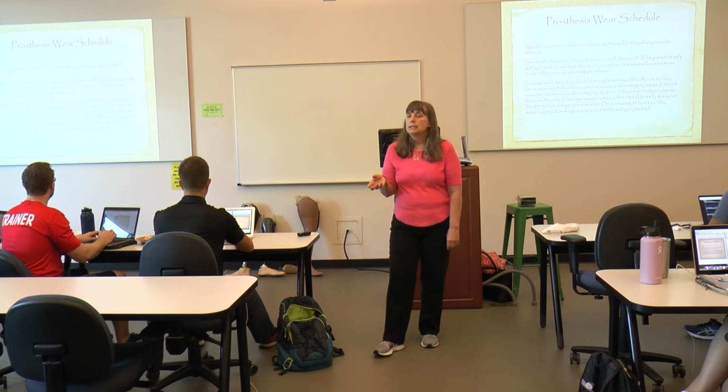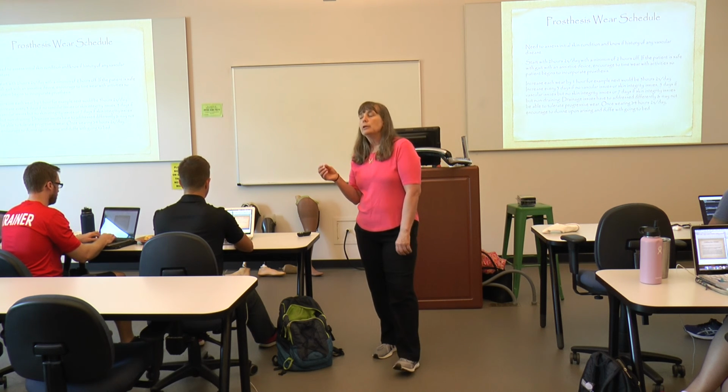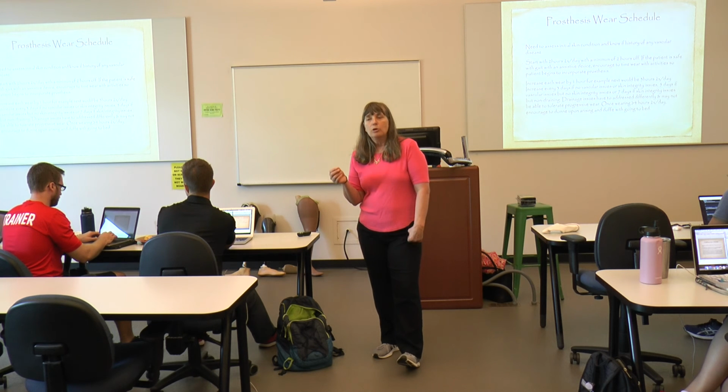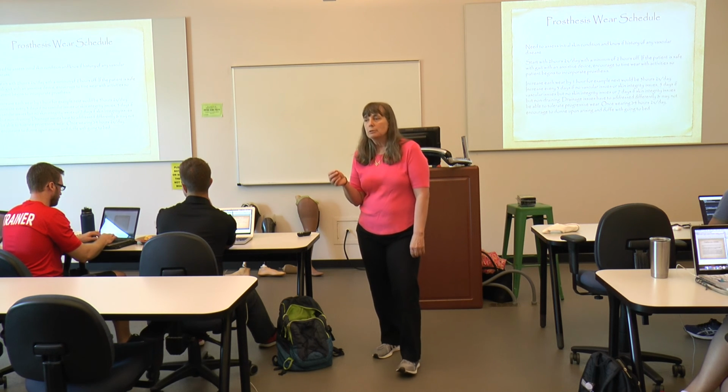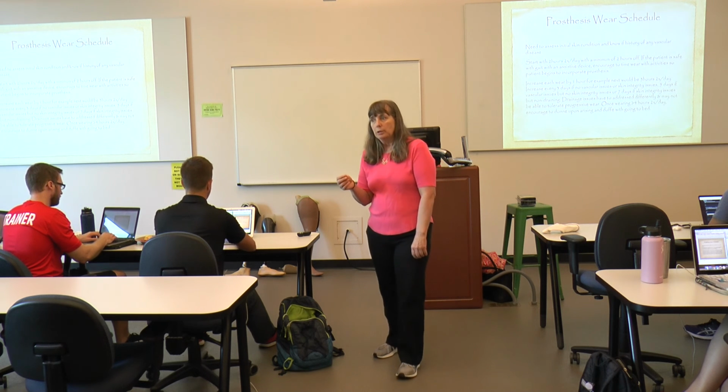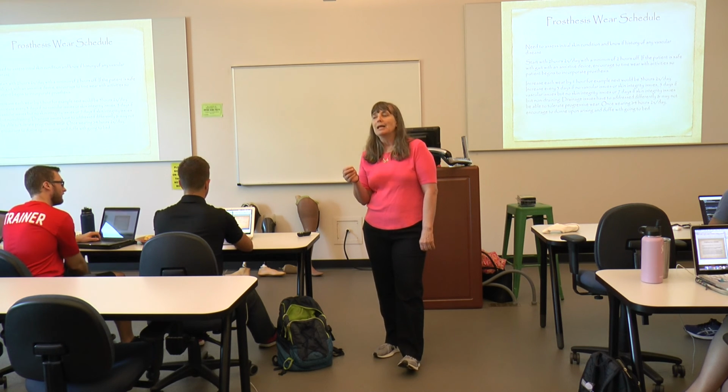Second question is, does it hurt? There is a difference between pressure and pain. Okay? You will take pressure on parts of your leg that you have never taken pressure on. That is not what we're talking about. I am talking about my leg hurts.